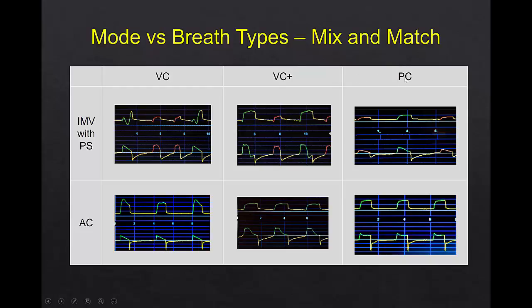Another way we do the ventilator breaths are pressure controlled breaths, where we simply pick the low and the high pressure and how long it stays at high and low. We pick low, we pick high. So here are 3 different modes lined up. Now, in this example, all of these modes have IMV style where intermittently we do a machine breath. In between it's spontaneous. With IMV with volume control, we did a volume controlled breath with 2 spontaneous allowed. In VC plus, we did the machine breath, and then in pressure control, we did the pressure breath.